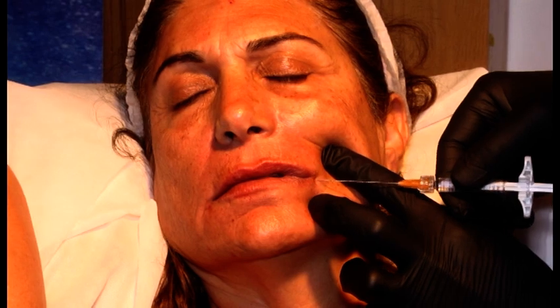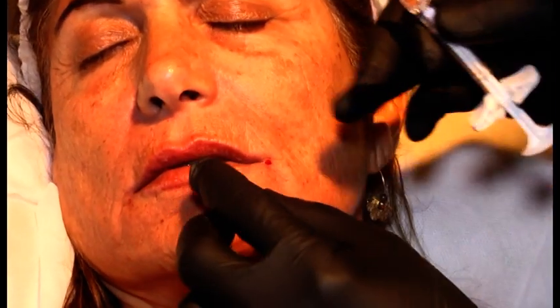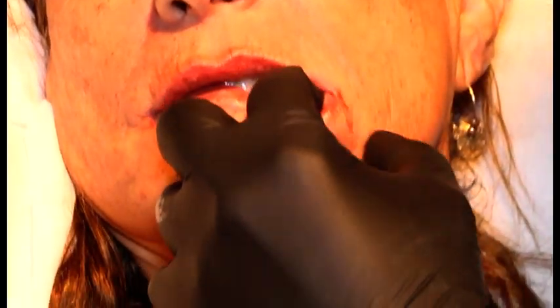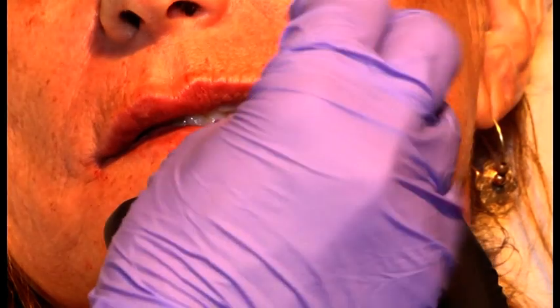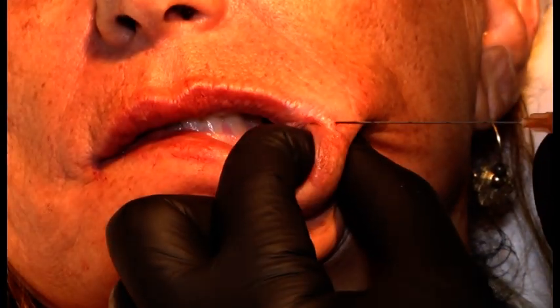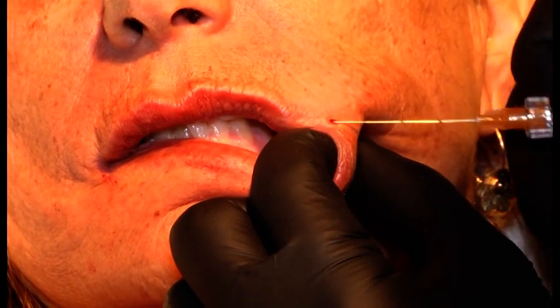And can you put that needle back on the contour? Can you open? Orit, can you swipe? Wipe, yeah. Can you put the Belotero lips contour with the needle, please?